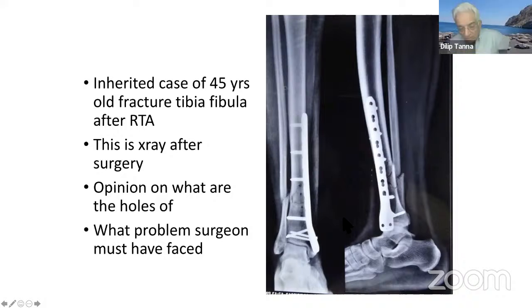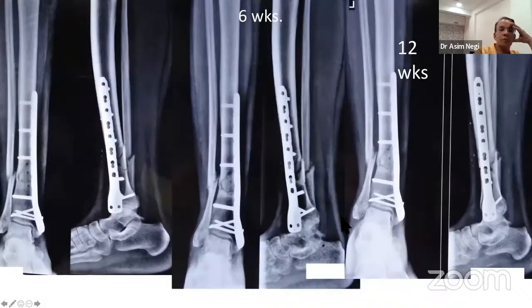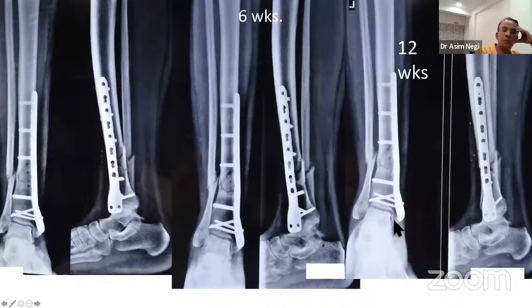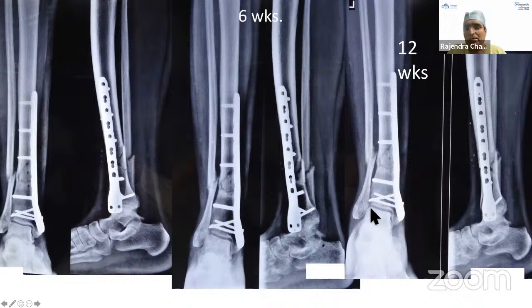Okay. So now next. This was at 6 weeks. The patient was still with the primary surgeon at 6 weeks. This was the picture. He was hoping that it would heal. And this was at 12 weeks, where gradually valgus continued to progress. So from an initial valgus of around 15 degrees, he has now progressed to 30 degrees.